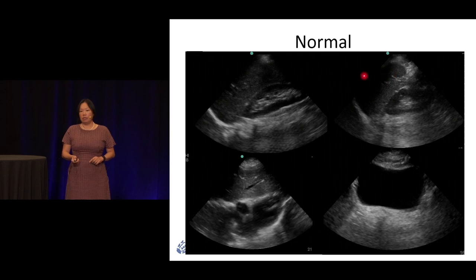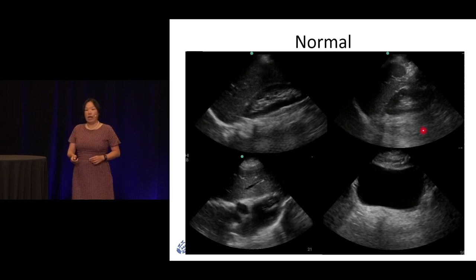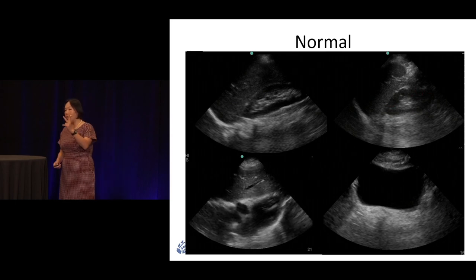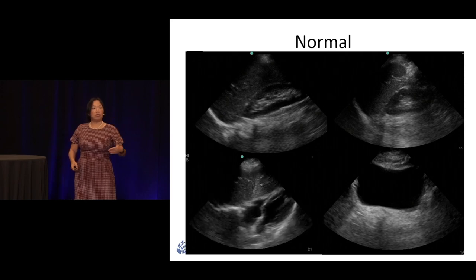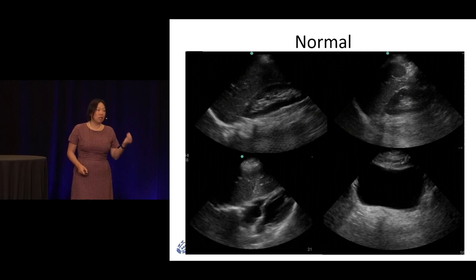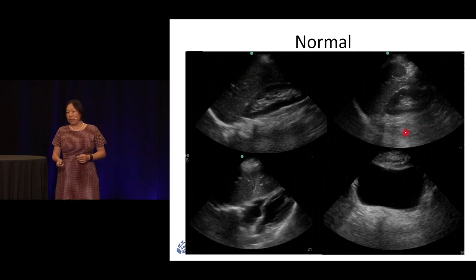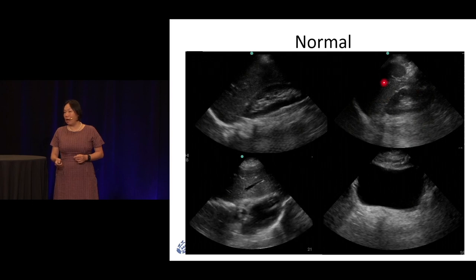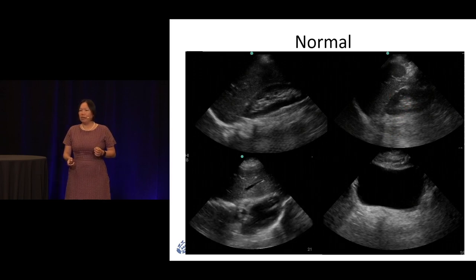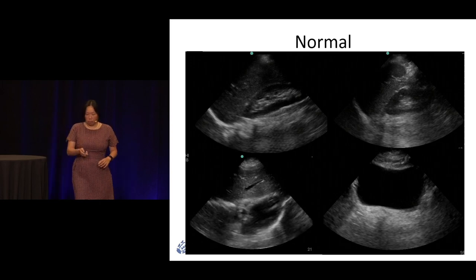Here's your smaller-than-liver organ on your left side — that's your spleen. And here is your kidney. Notice that the kidney has two different colors. The more water you have in the tissue, the darker it is, because water is anechoic. The kidney cortex on the outside and the pyramids are very water-rich. In the middle, the renal pelvis has more fatty tissue, so it's brighter. So the kidney's two-toned appearance reflects its tissue composition — basic principles.